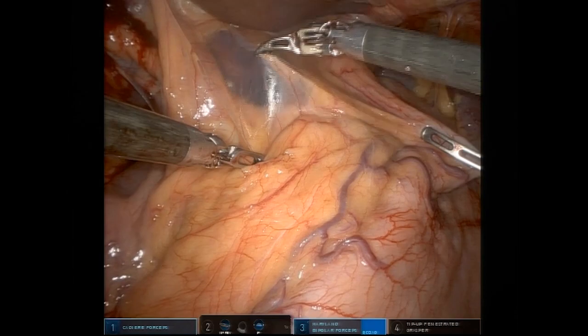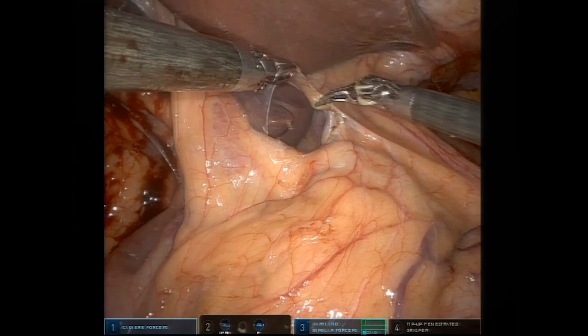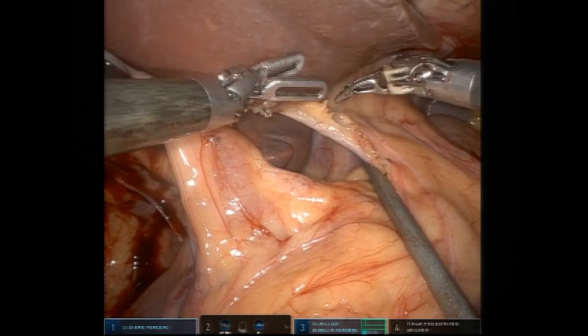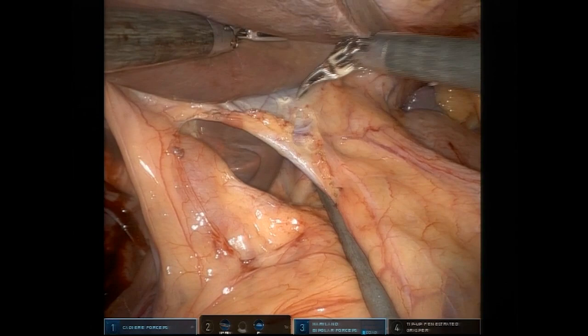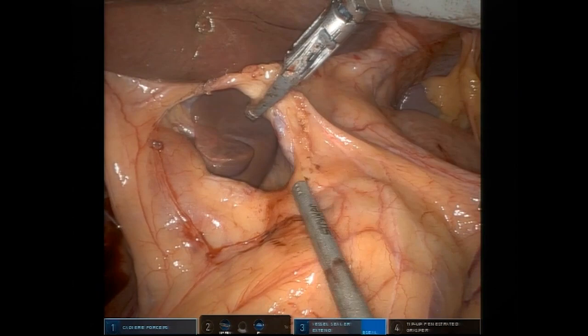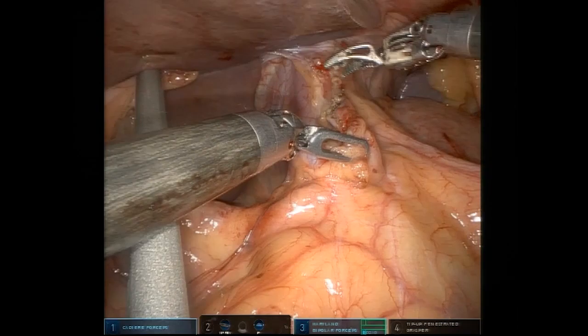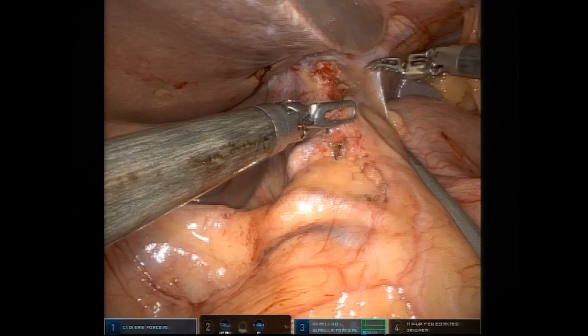Abdominal dissection begins with mobilization of the hiatus after incising the pars flaccida. Hiatal attachments to the esophagus are taken down with the bipolar device until the intra-abdominal esophagus is fully mobilized.